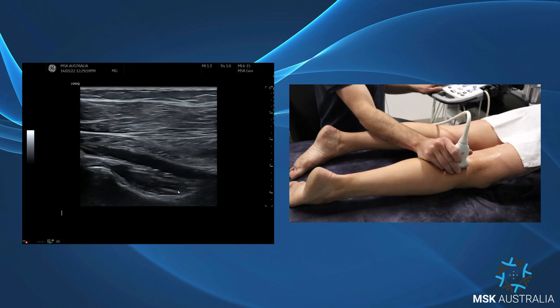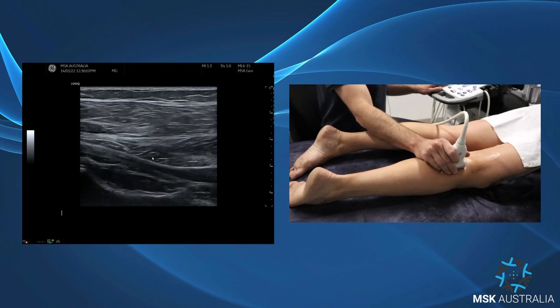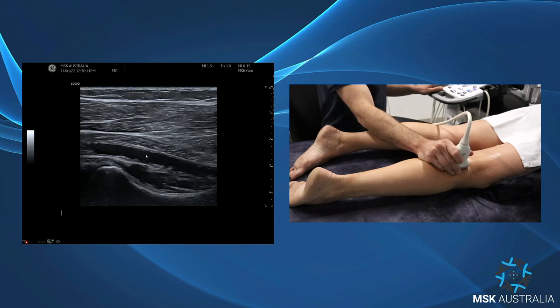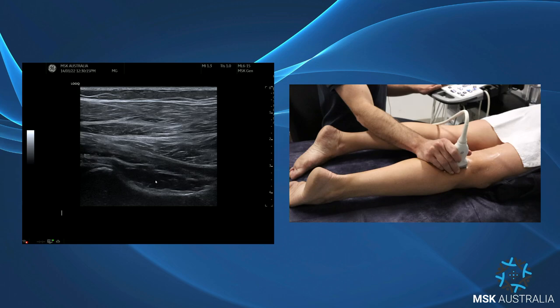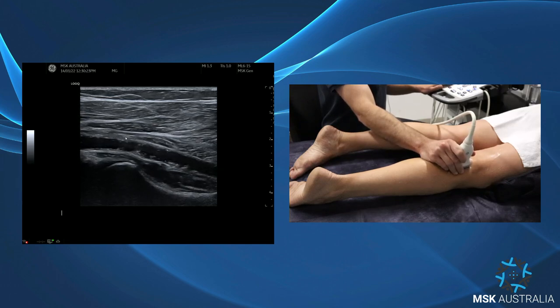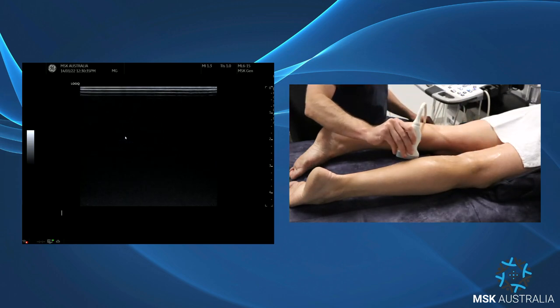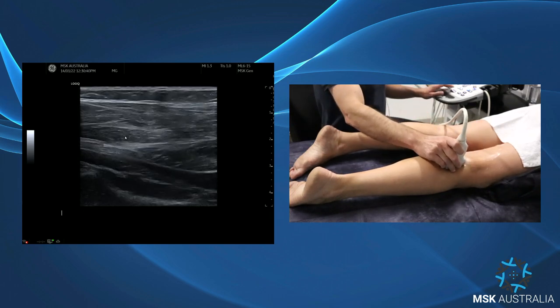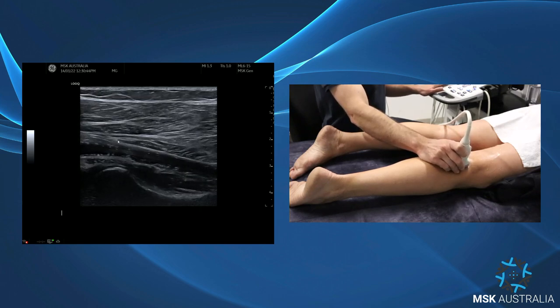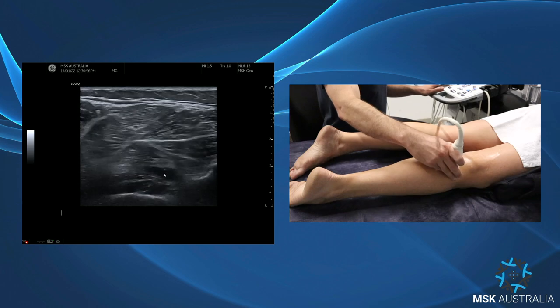Following up in long axis, it's usually easiest to appreciate the soleal sling or soleal arch in the long axis view. It can be a little hard to see, but the muscle underneath is popliteus. Over the top is soleus, and we can see the soleus come up to a point — quite a high point here. The soleus has an insertion off the upper quarter of the fibula and the mid-third of the tibia, and the sling wraps across between those two in an oblique orientation. That little point we can see — that's our soleal sling right there.